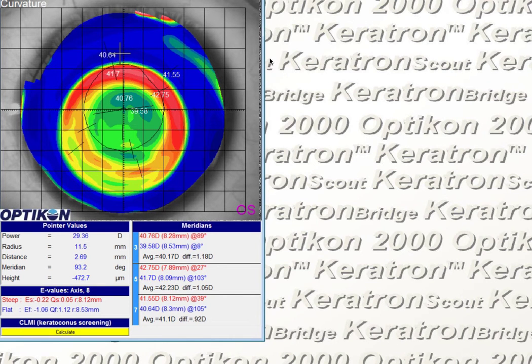In this orthokeratology case, we have a patient whose lens is riding a little bit low. The treatment zone is decentering inferiorly. There's a little bit of overcorrection, and the amount of reverse curve within the pupil is causing glare, both in daytime and nighttime situations.